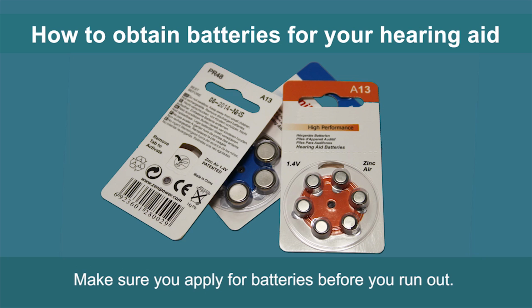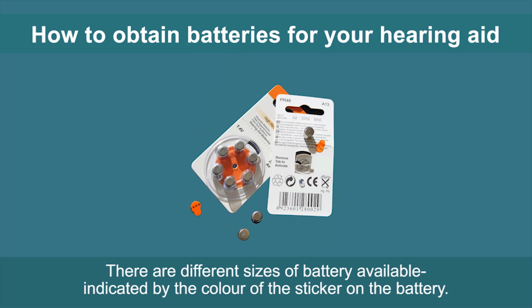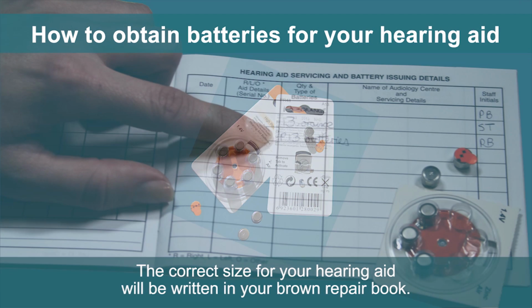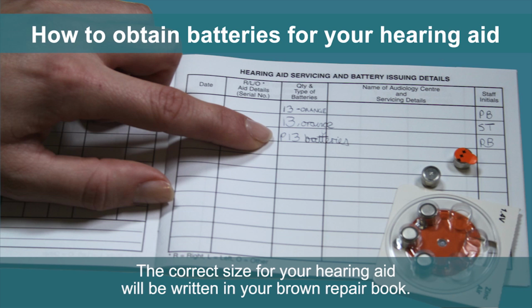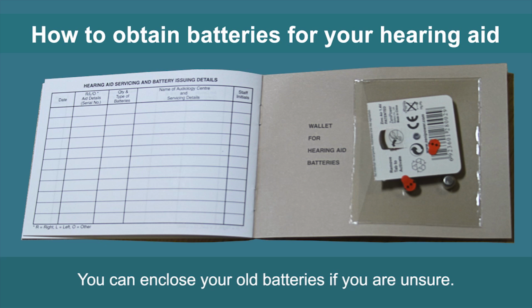Make sure you apply for batteries before you run out. There are different sizes of battery available, indicated by the color of the sticker on the battery. The correct size for your hearing aid will be written in your brown repair book. You can enclose your old batteries if you are unsure.